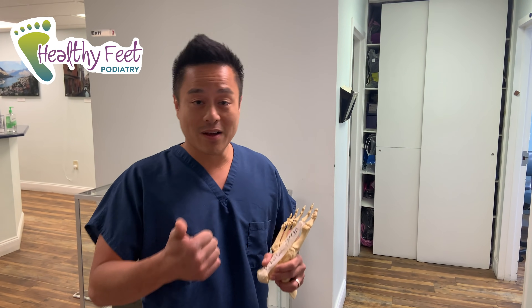No more big scars — we can do this minimally invasive. You don't have to go to the surgery center or the hospital; we can do it right here in the office. It takes about 15 minutes, with less pain, less scarring, and less swelling. Watch this video.